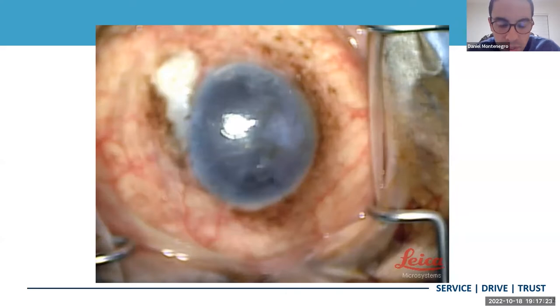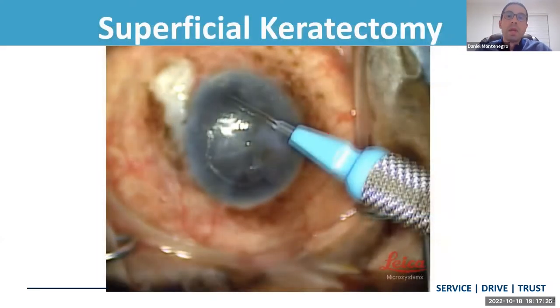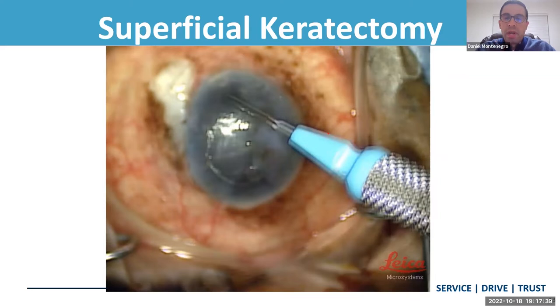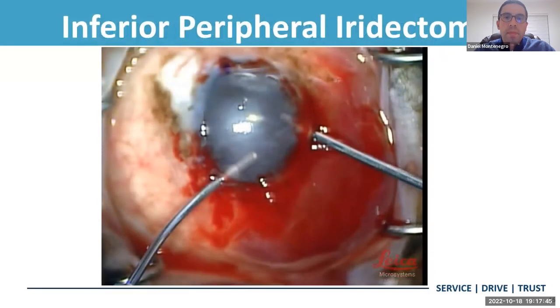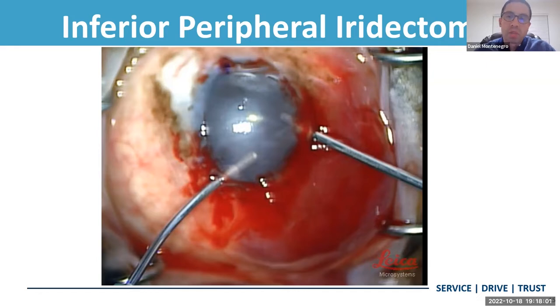This is the intraoperative view from the microscope. As you can see, you can barely see the pupil in this eye — there is diffuse edema, and on the top left you can see the bleb with a whitish color. I was considering a PKP because my view was obviously very poor, but I know that PKP is a more invasive surgery. I would rather do my best to perform a DSAEK and provide the advantage of faster visual recovery and less surgical risk. What I'd like to do first in cases with very limited view of the anterior chamber is to do a superficial keratectomy — using a beaver blade to remove about 80% of the epithelium. After that, you can see the pupil is round and I can see the reflection of the PCIOL, which is well positioned.